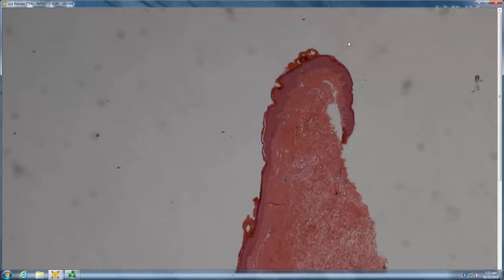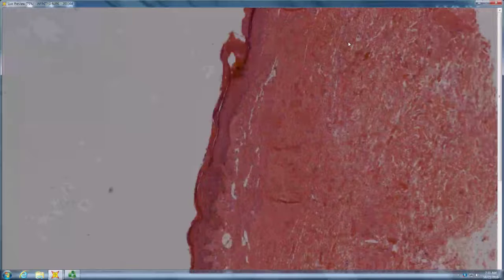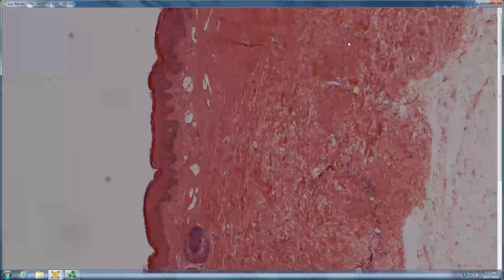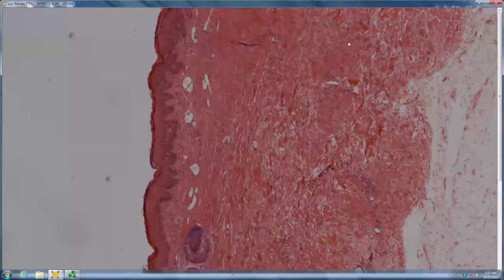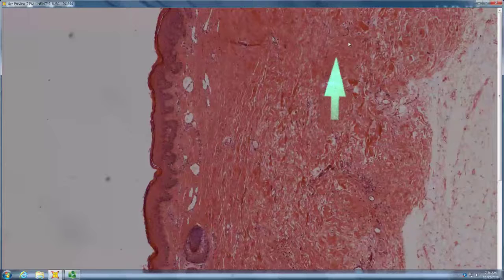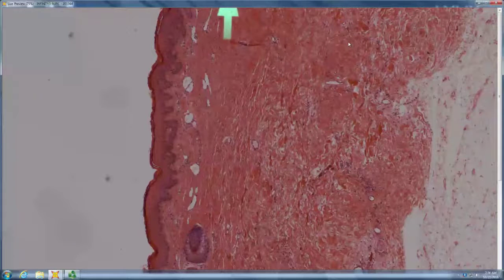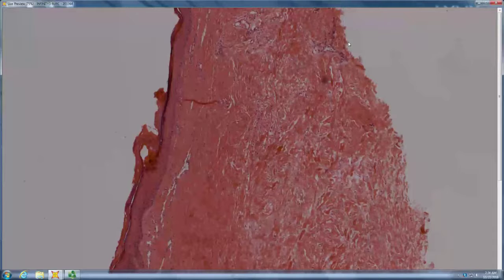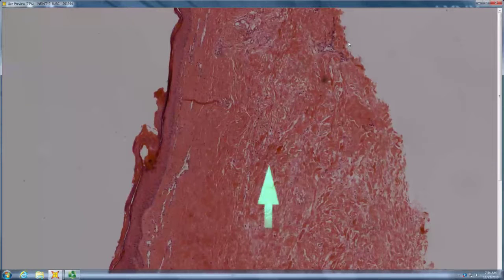So, another relatively small biopsy. There's hyperkeratosis, homogenization, but no lymphoid band. Adnexal structures present or absent? Present. How about periadnexal fat? Not so much. So they're trapped. How about space between collagen? It kind of varies. Here there's not so much; other areas, it's a little more preserved. So what do you think? Possibly morphea, and probably a superficial morphea, because you see much more loss of space between collagen bundles high than you see deep. Probably a nice example of a superficial morphea.